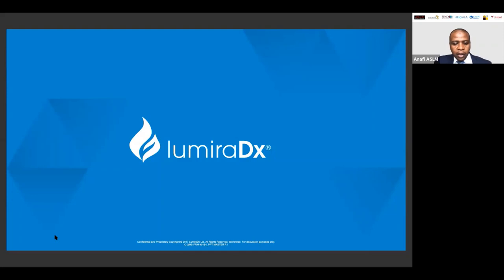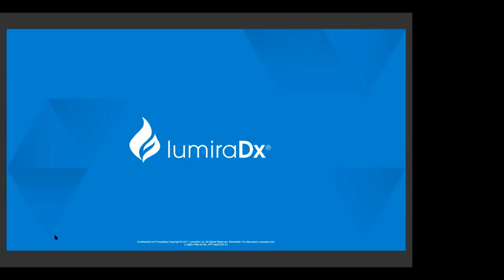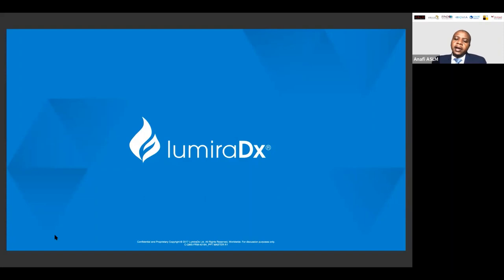Thank you once again. And the other question was on the extraction buffer. Once the sample has been put into the extraction buffer and the extraction process is completed, you have a five-hour window in which to run the test with that extraction buffer. And then we recommend that you freeze the sample. You can freeze the sample and then you can thaw it and run it later. Oh, okay. Thank you for clarifying that.